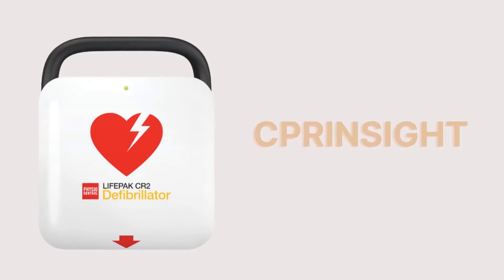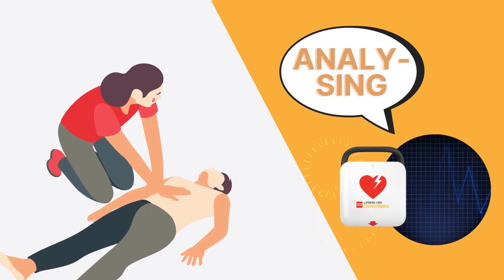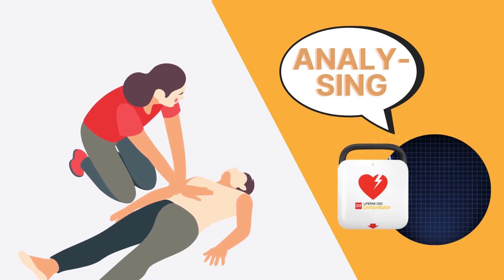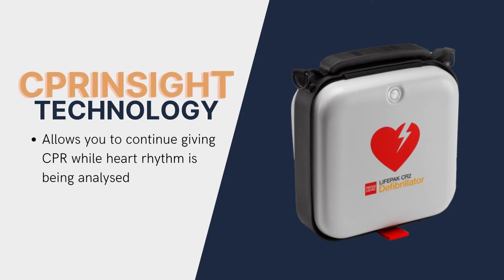The LifePack CR2 also comes with life-saving CPR insight technology. You won't need to stop giving CPR when the defibrillator is analysing your patient's heart rhythm. This machine can detect the heart's condition while CPR is given, meaning more time for life-saving CPR and less time waiting.